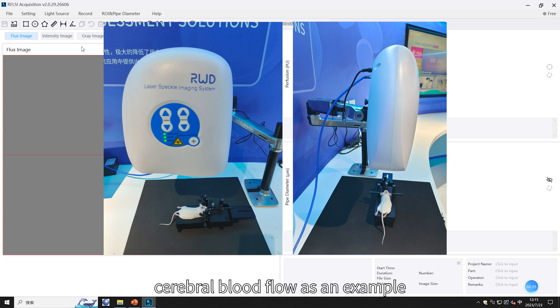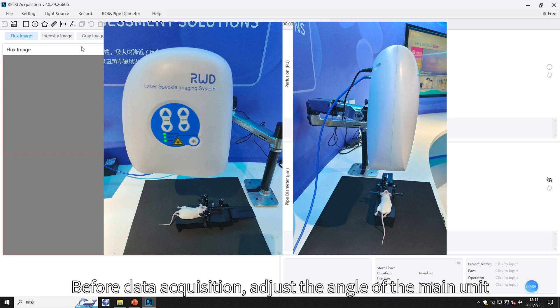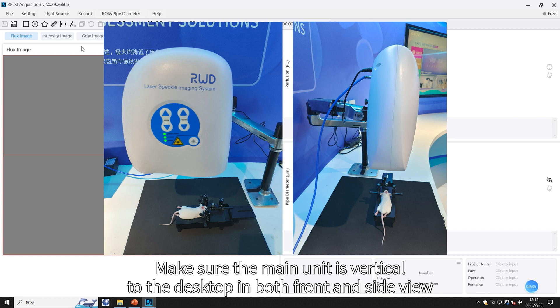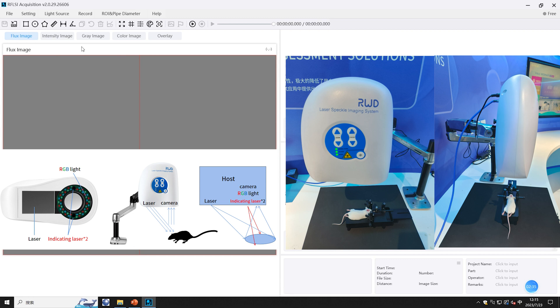Next, we will demonstrate the operation of the software by observing cerebral blood flow as an example. Before data acquisition, adjust the angle of the main unit to make sure the main unit is vertical to the desktop in both front and side view, because the imaging laser is illuminated from one side at an angle as shown in the figure.